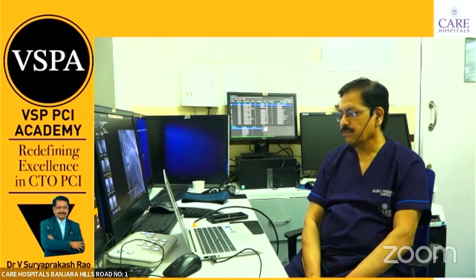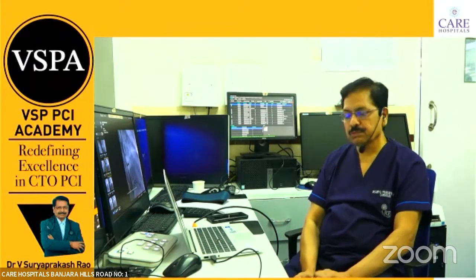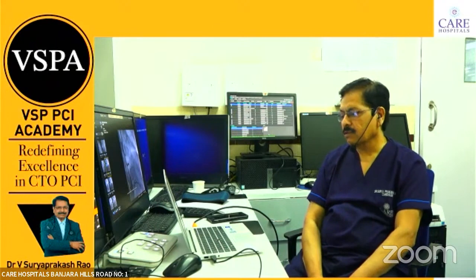And whenever you have this, you should not have too much bleeding. That's why the push-pull Y connectors, some of the companies have got a very good Y connector. So less blood loss is the key here, long procedures.